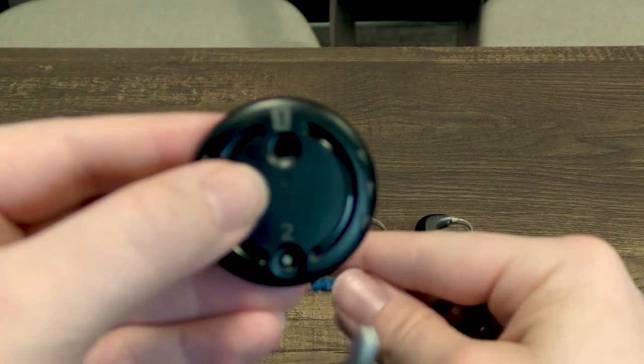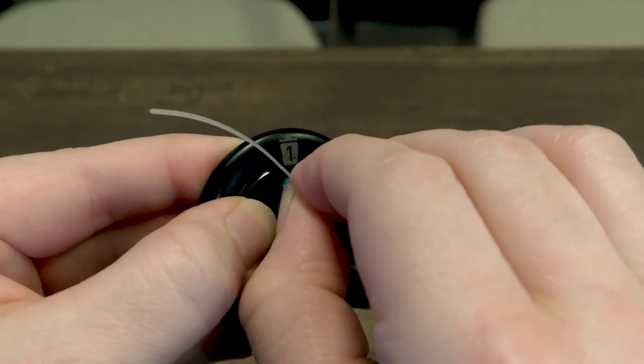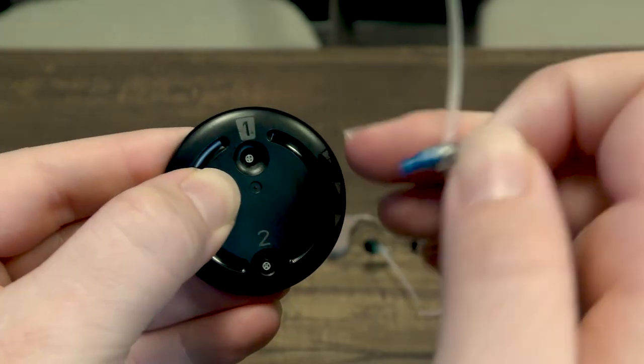So what you do is you want to click the hearing aid into number one and you'll feel it kind of click in and then you simply pull it out and you can see the old filter in the number one spot.